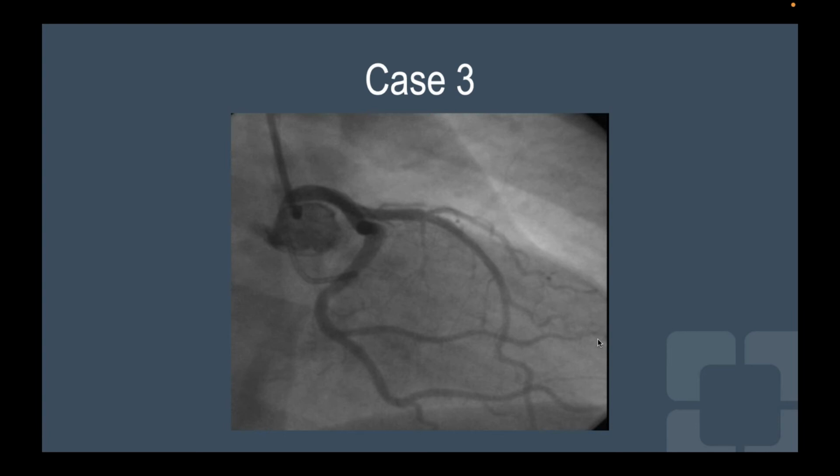This patient here is the patient going to therapy. You can see here the catheter angiography of the left main, and I know you can see my cursor. So this here is the LAD. And why do we know this is the LAD? A trick for you guys when you look at these cases: it's the one that's going to have the branches pointing toward the patient's feet. So you see this one here, that's a septal perforator. This one here is a septal perforator as well. So when you're not sure which vessel you're looking at on this left main injection, the one with the branches pointing straight down towards the feet, those are your septal perforator branches. So that's going to be your LAD.